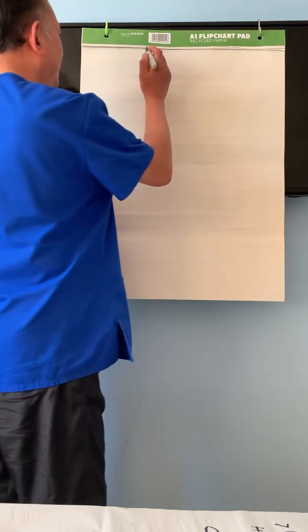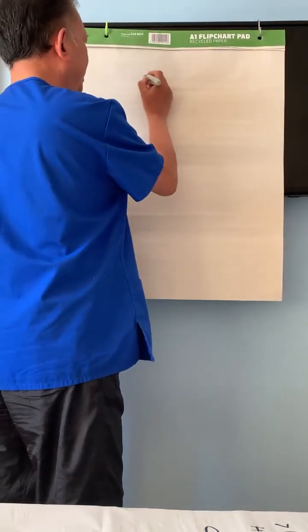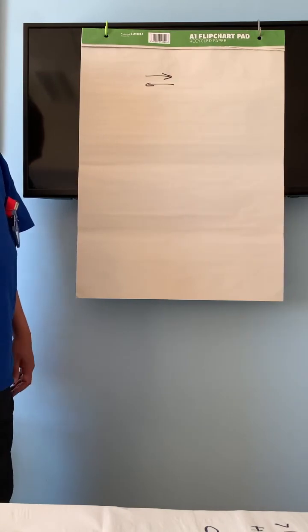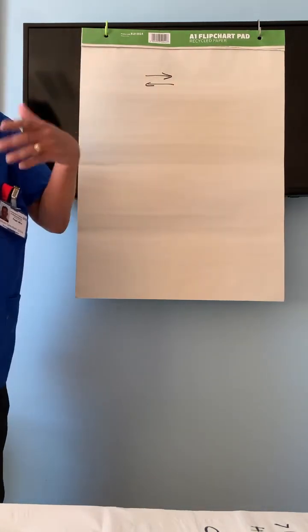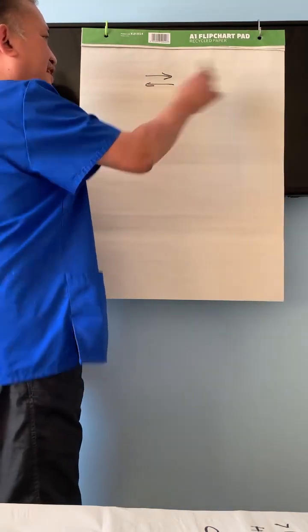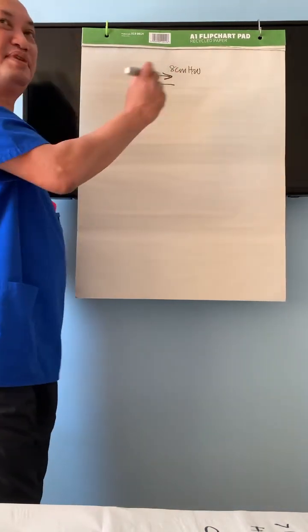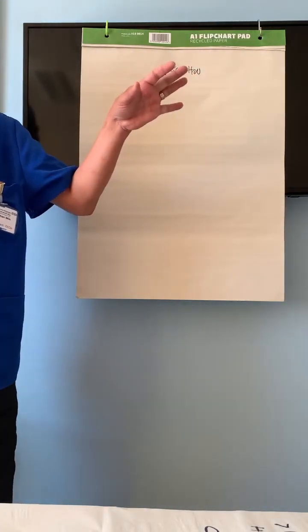So now we go to the BiPAP. CPAP also has inspiration, expiration. CPAP is also blowing in and giving pressure at the time of blowing out. It is continuously blowing 8 centimeter water, even at the time of breathing out, delivering the same pressure to prevent the airway collapse.